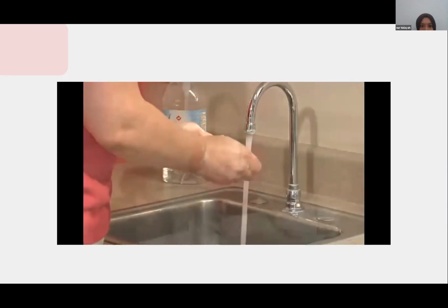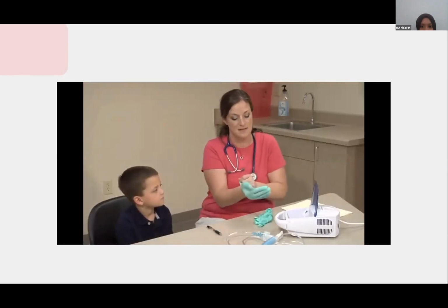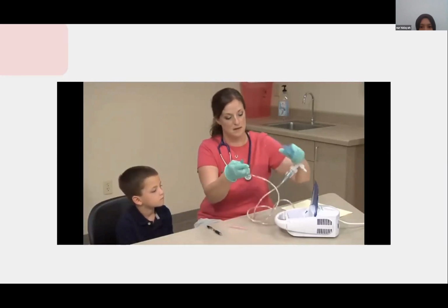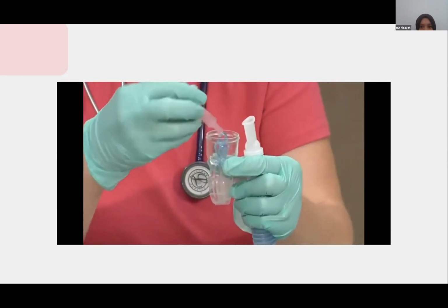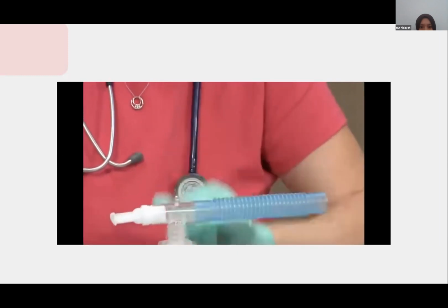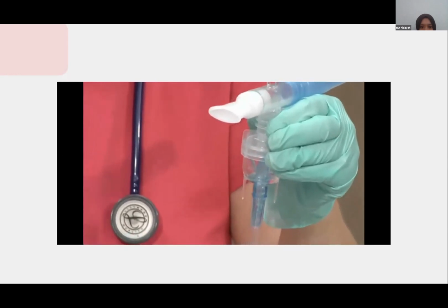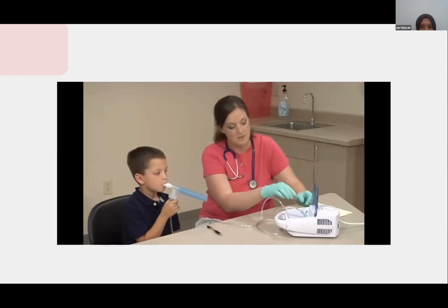Wash your hands. Set up and plug in the nebulizer machine in a location where the power source is close to a comfortable location for the medication to be administered. Follow the directions for the specific brand of nebulizer machine and cup. Unscrew the top of the nebulizer cup. Add medication into the bottom half of the nebulizer cup. Screw the top of the cup back on. Attach the tubing from the cup to the nebulizer machine and the cup onto the face mask or mouthpiece. Place either the face mask on the student or have the student put the mouthpiece in his or her mouth.